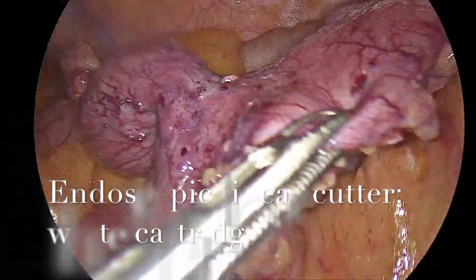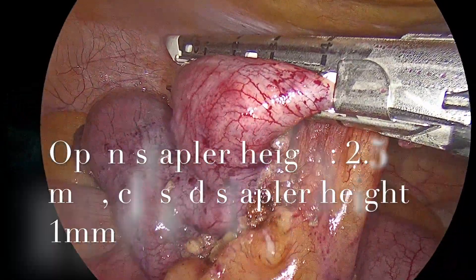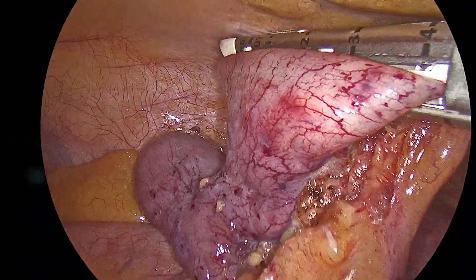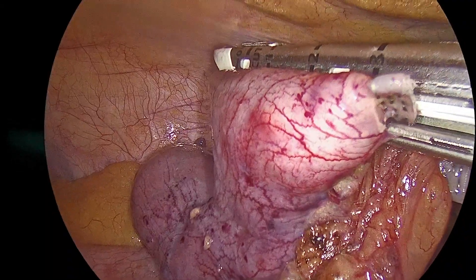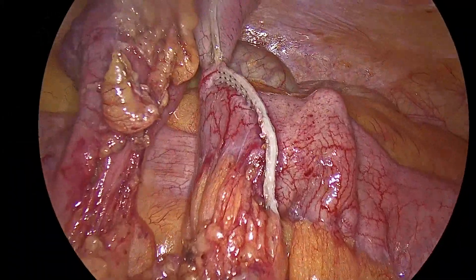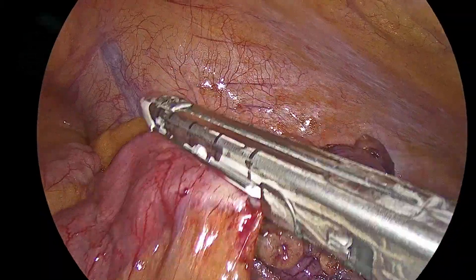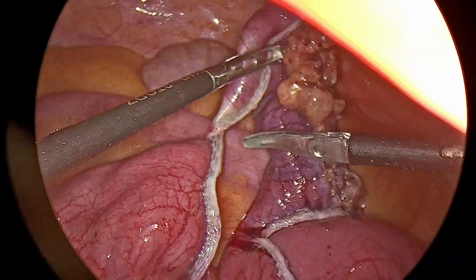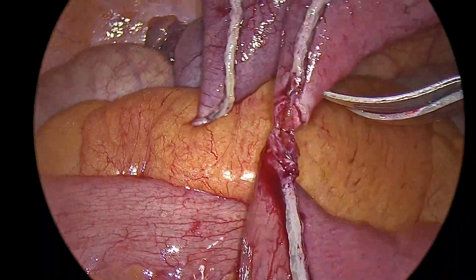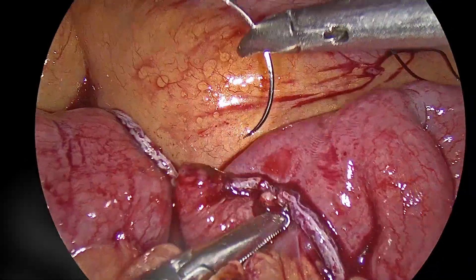Now, since the division of mesentery is complete, we will divide the ileum on both sides. We are using an endoscopic linear cutter stapler with a white cartridge, which has an open height of 2.5 mm, closed height of 1 mm, and throws three rows of staples. After firing the stapler on both ends of the ileum, we resect and separate the specimen by dividing a small bit of the antimesenteric border with scissors. We will then anastomose the two segments intracorporeally by side-to-side technique.